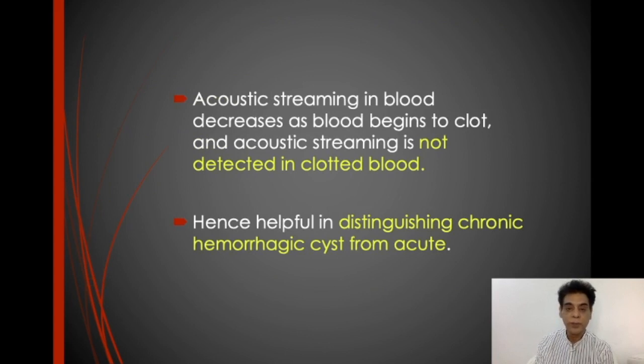Now, this part I've already told you: as there is clotting, the acoustic streaming disappears, and you won't be able to see acoustic streaming in clotted blood. You won't be able to see acoustic streaming in a chronic hemorrhagic cyst.